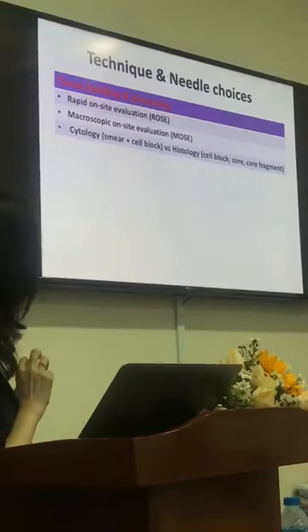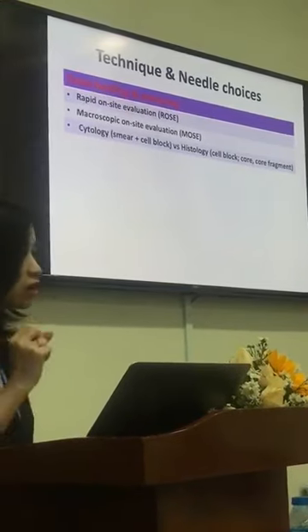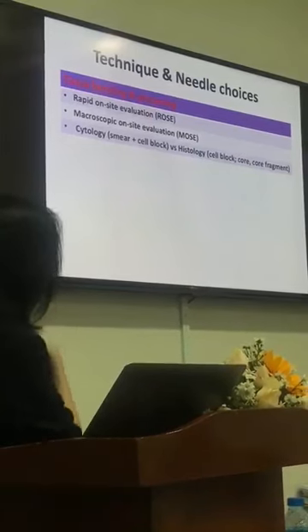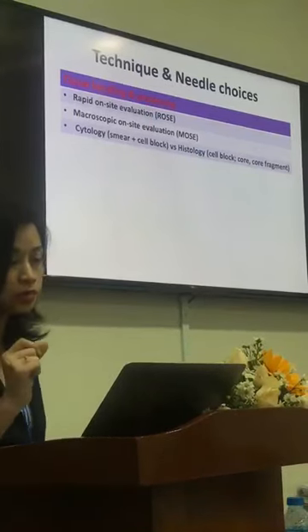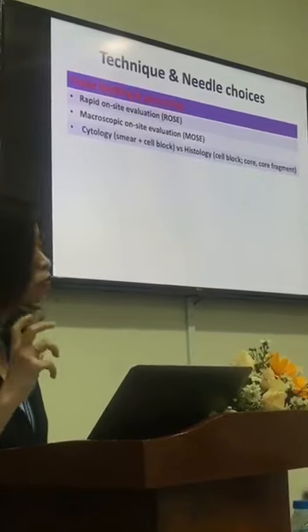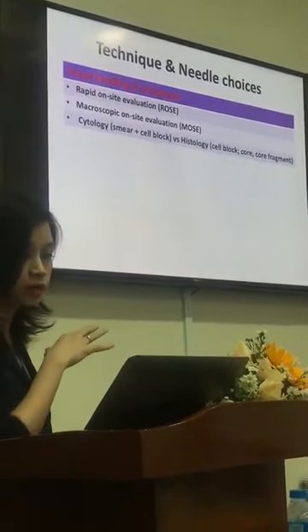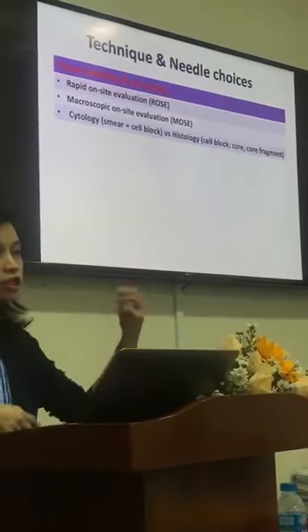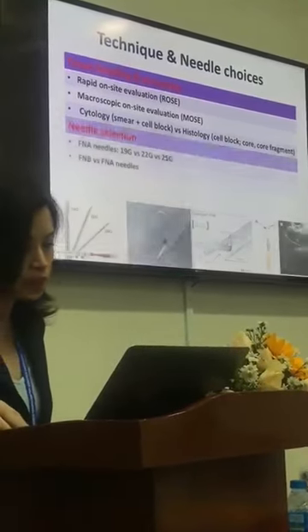The other thing that people talk about is doing cytology alone, which is FNA, versus doing histology by using a needle biopsy or a cell block preparation, and we'll talk about it a little bit. Okay, so what you need to know is ROSE, MOSE, cytology, and histology.